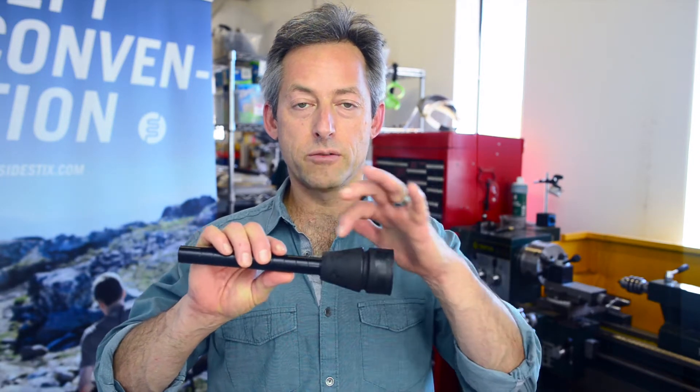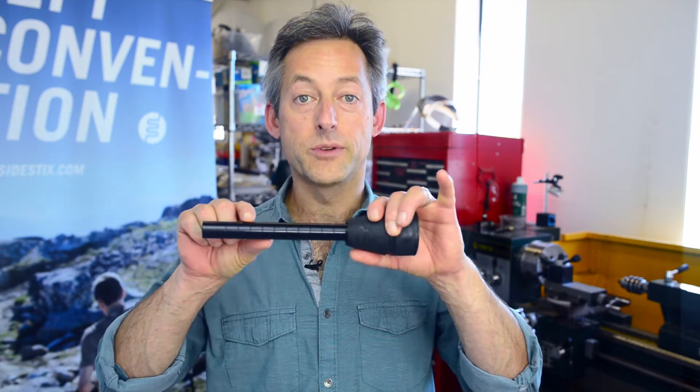Hi, my name is Kareth. I'm from Side Sticks and today I'm going to show you how to take a rubber tip off the aluminum tip adapter.